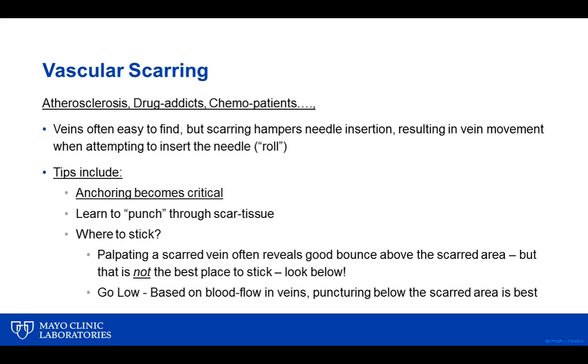Those veins jump. You hear patients tell us they roll. We know they're not down there physically rolling, but they do move. And this can be compounded when the vessel is scarred. The needle will actually struggle to enter the vessel and push it off to the side. So, some tips to help prevent that. You notice that first bullet point is underlined, because anchoring that vein is crucial in helping to get that needle through it.